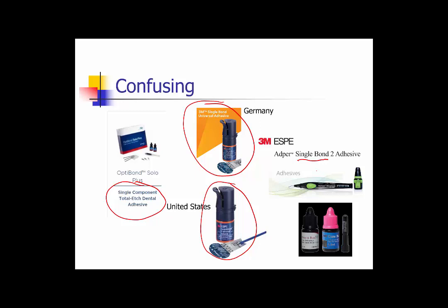Adhesive from Ivoclar is a self-etch product. Prime and Bond NT is a 4th generation product, and by the way, it also has a self-cure component. And so we can use Prime and Bond NT with the self-cure component for dual cure composite core materials. But can you use it with the composite core you're using that isn't a Dentsply product?